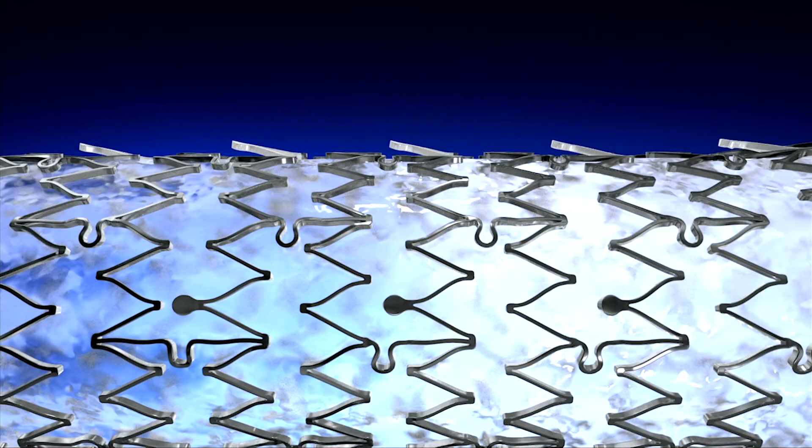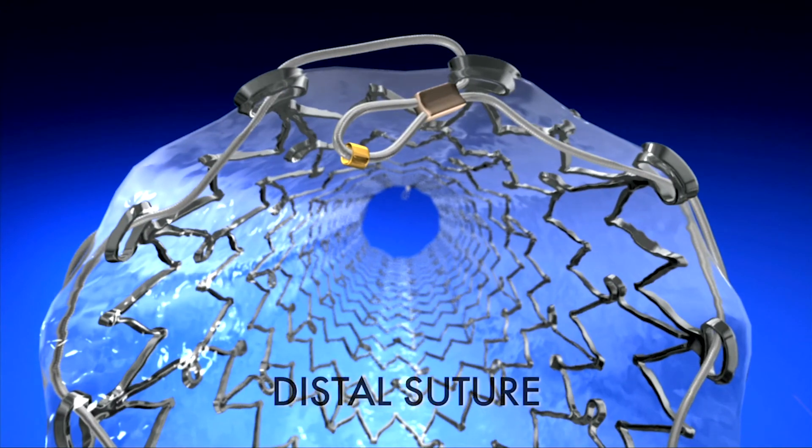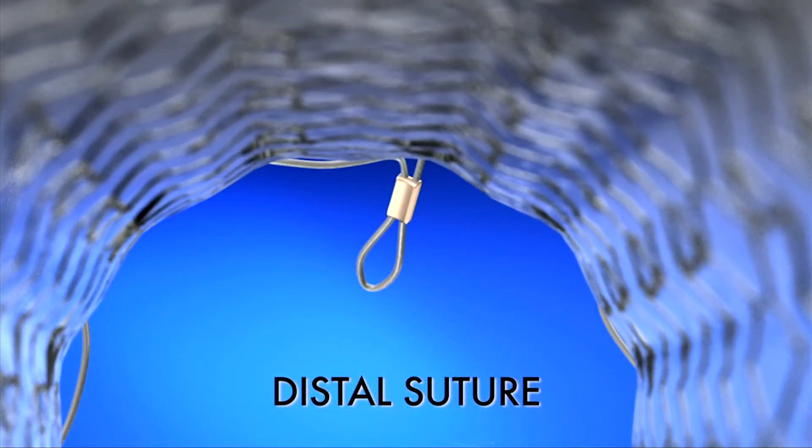Proprietary anti-migration struts run throughout the stent and are designed to reduce stent migration. A metal proximal and distal suture provides a means for distal and proximal repositioning and removal of the stent immediately post stent placement.